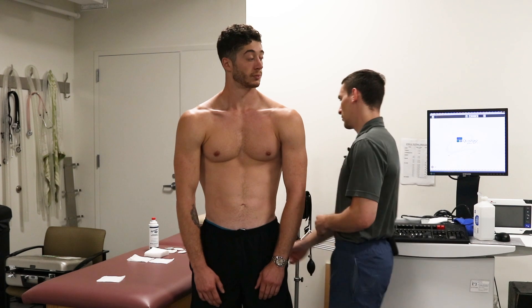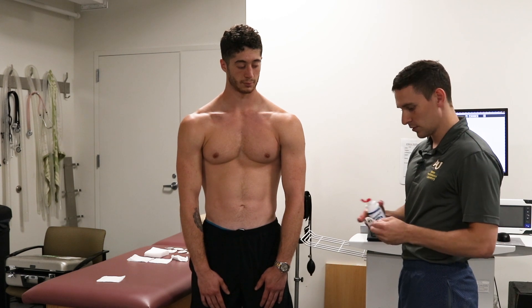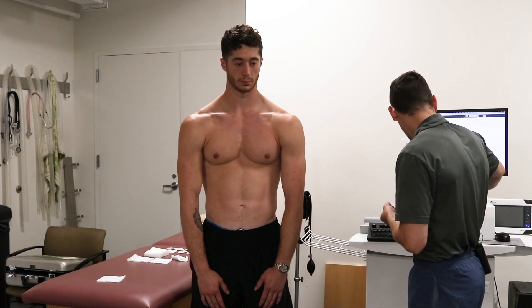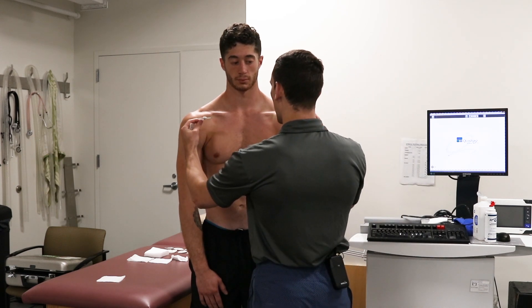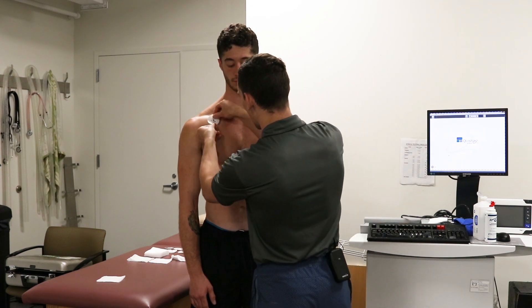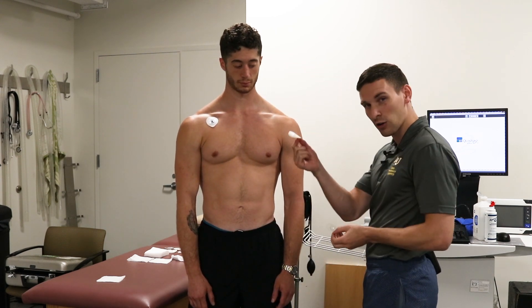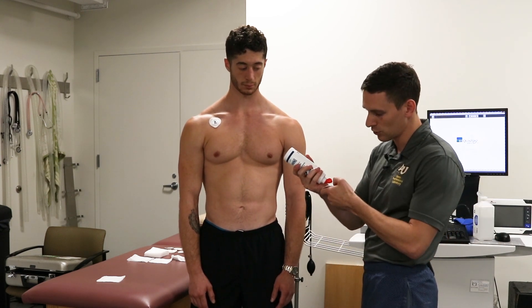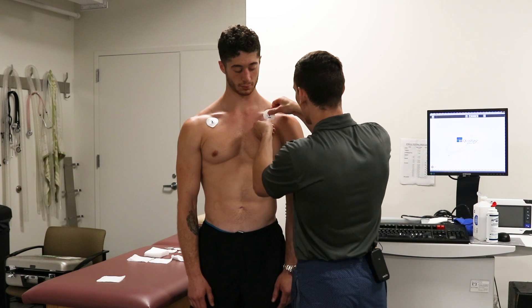From there we'll take our electrodes. We're going to put just a little bit of ultrasound gel on them, only in the very middle where the conduction is taking place, and place those leads directly in those spots. We have our red spots from the abrasion and we can use that for the placement of our leads. Now some electrodes come wet already with some kind of gel on them. These do not, and that's why we use our gel. If you already have gel on your electrodes there's no need to add extra.